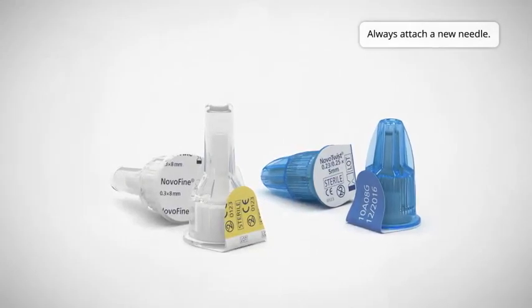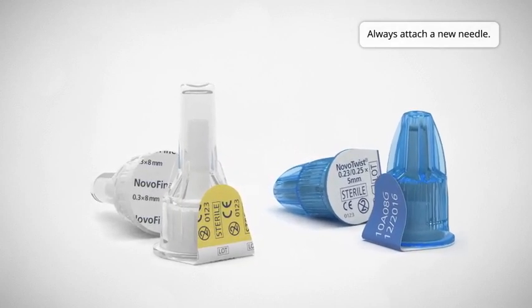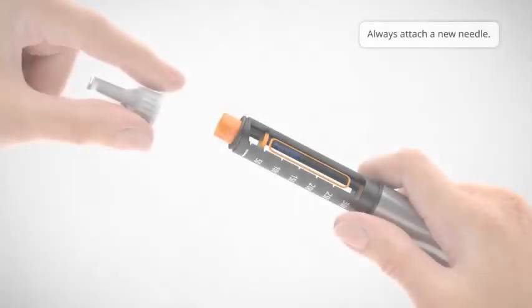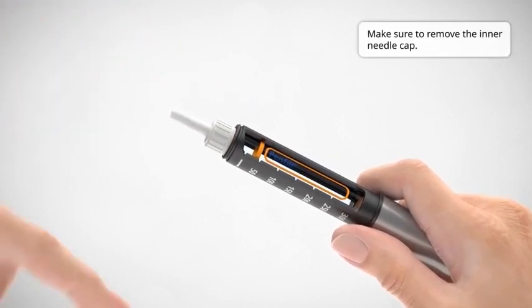Right before injection, always attach a new needle. This reduces the risk of blocked needles, contamination, infection, and inaccurate dosing. If using NovoFine, screw the needle straight and tightly onto the pen.